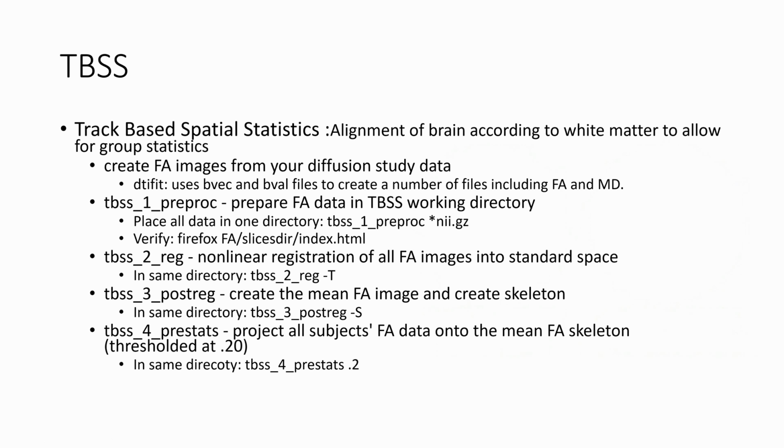If you've switched back and forth between different processing paths, maybe a little bit in AFNI, maybe a little bit in SPM, or what have you, then sometimes you'll notice that the right to left, inferior, superior has all been switched around, and the brains will come out in very weird basic alignments, and you would want to check it here. Next is that nonlinear registration that we were talking about.